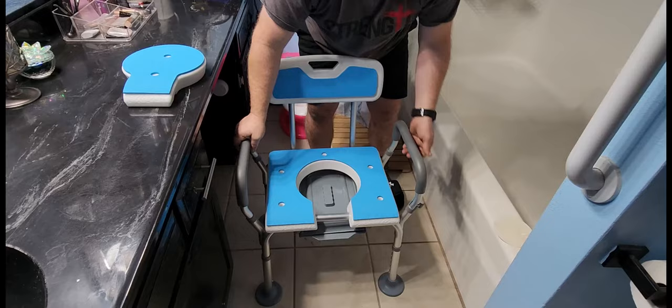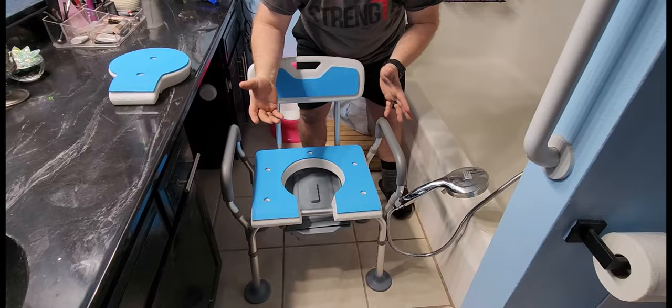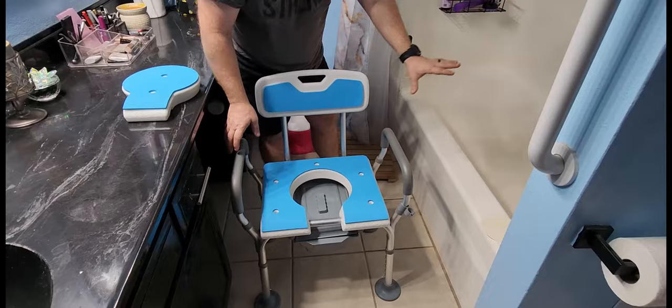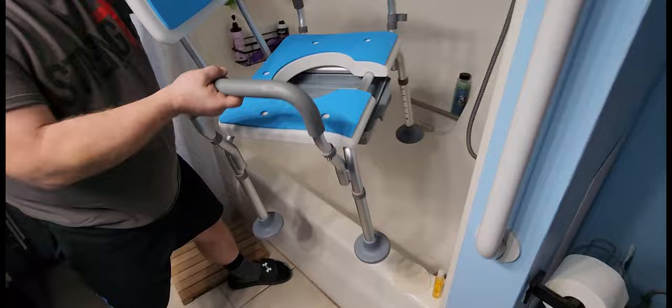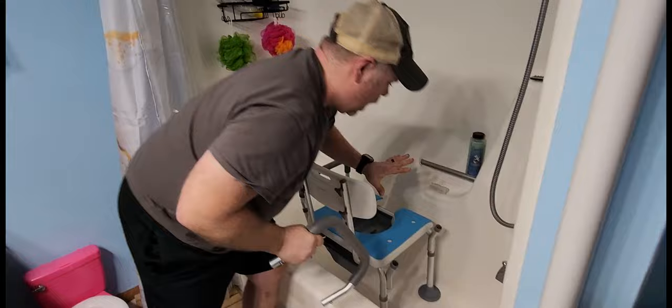This is going to fit best in the shower and will work really well if you've got a shower head like this, so you can hang your shower head there while washing the rest of your body, then pull it off the hook and use it how you will. This is a standard — actually a little bit narrow — tub, and this chair is not going to fit in here except sideways. I could leave it in here like this and pull an arm off and use the shower chair that way, but it's going to work best in a standard-size shower facing forward.